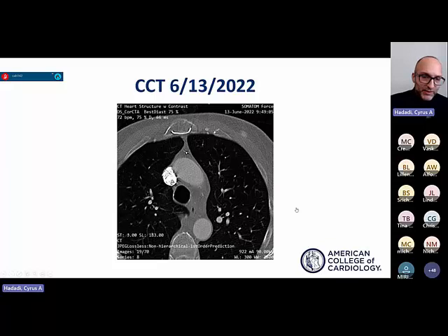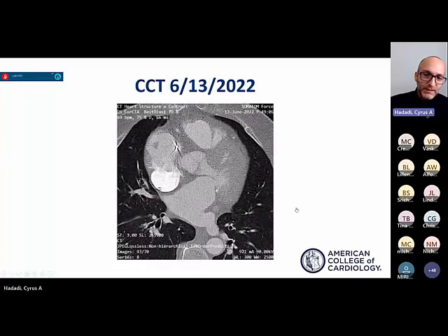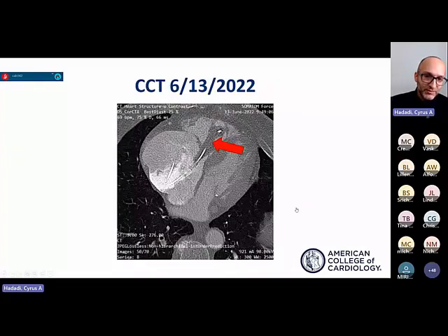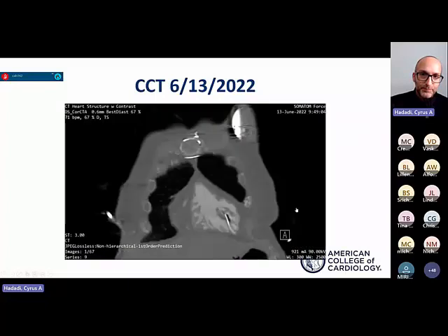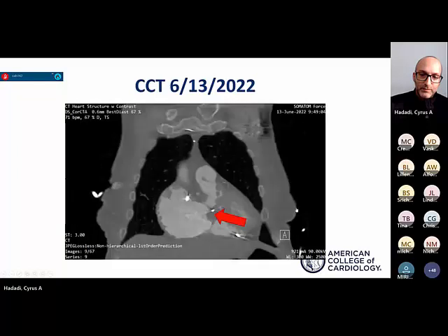So I will always get cardiac CT on any patient with possible infected leads, not only to evaluate the course of the leads through the vasculature, but to take a look at the leads inside the cardiac chambers themselves. So if you follow these leads out, and I'll play this again, you really can see that there is, once again, extensive echodense material surrounding the entire body of the right ventricular lead. And there is an intimate relationship here with the tricuspid valve apparatus.